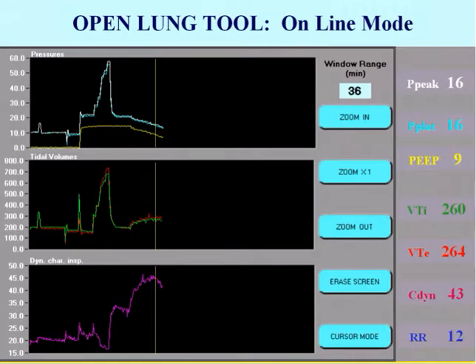So, to my knowledge, this is the first possibility that the clinician has at the bedside to detect lung collapse and titrate PEEP levels, so as to optimize the recruitment procedure. Recruitment is submitting the lung to a very high stress with its pressures, and we should be sure that we find exactly the point at which we can maintain this lung stable, in order to avoid excessive numbers of recruitment maneuvers due to lung instability.